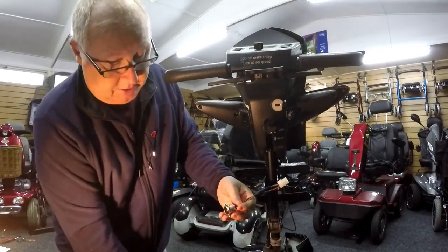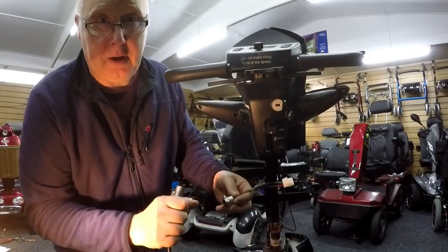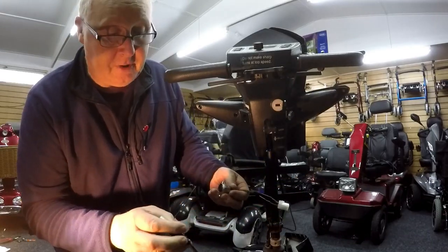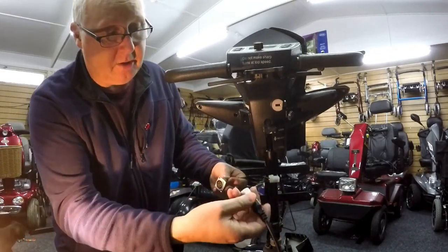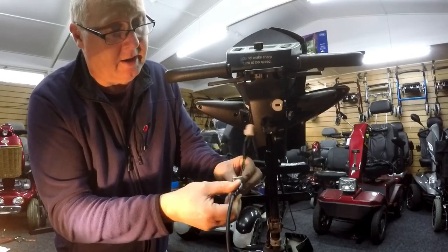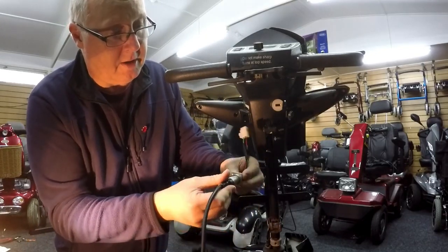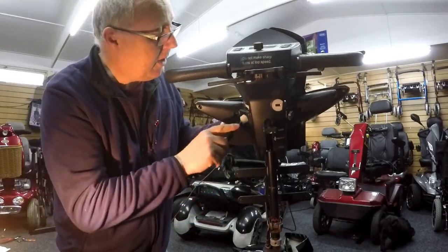So that connection here now should make a proper fit and should stop the lights from flashing orange, and should charge the batteries no problem, because this particular connection is designed to go with this. It's a much easier, tighter fit. Where are we? Yeah, much tighter fit. So we'll just put that back together.